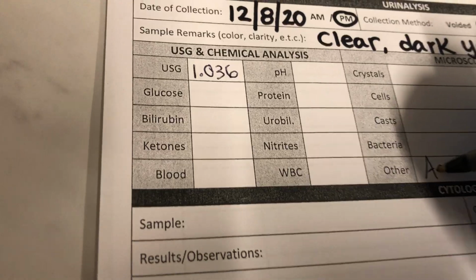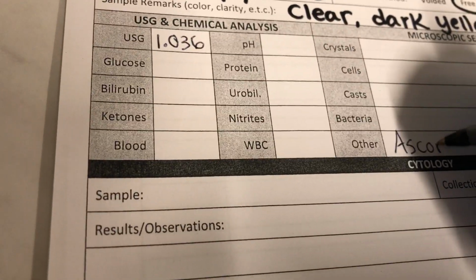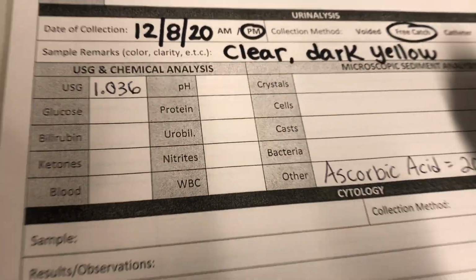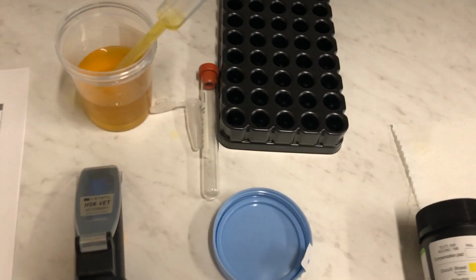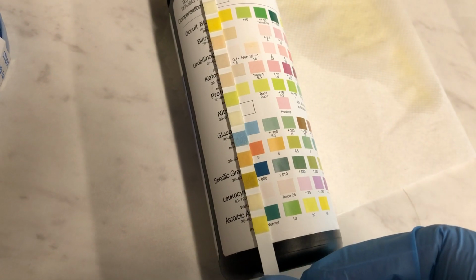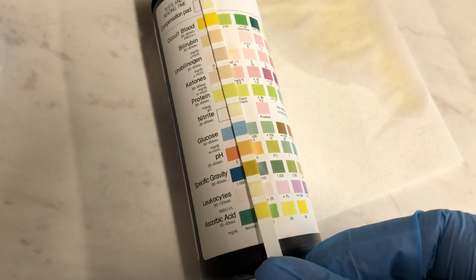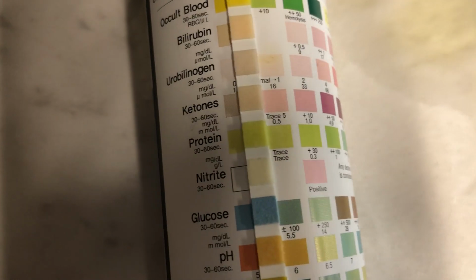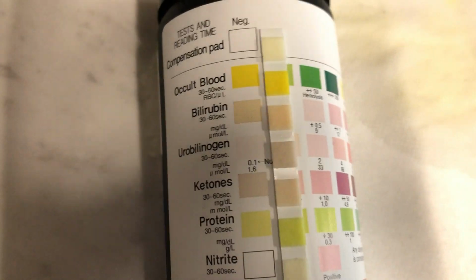So I will come over to here, and I don't actually have it on this form, so I'm going to write it in. Ascorbic acid equals 20. Okay. And then we want to continue to read the rest of the strips at the right time. So I'm just going to take a quick glance at this. pH, which is that light orange color. When I hold it between the two, it's definitely closer to the 6. Glucose looks negative, nitrites look negative.